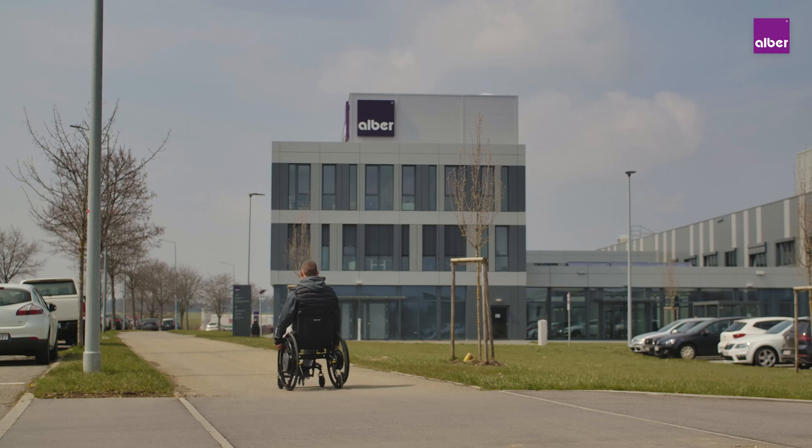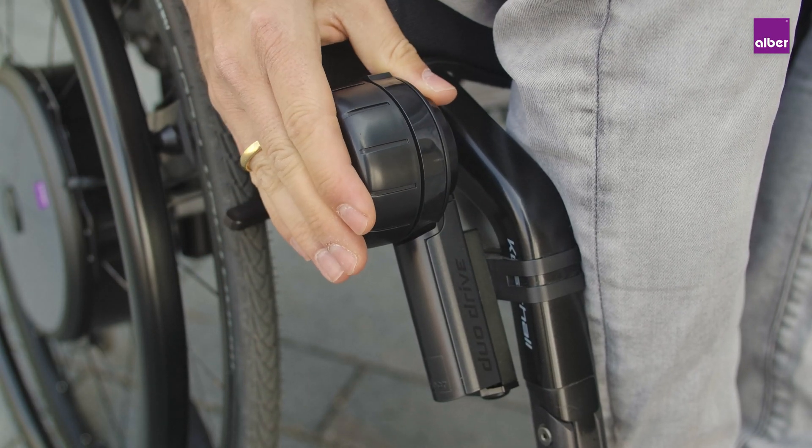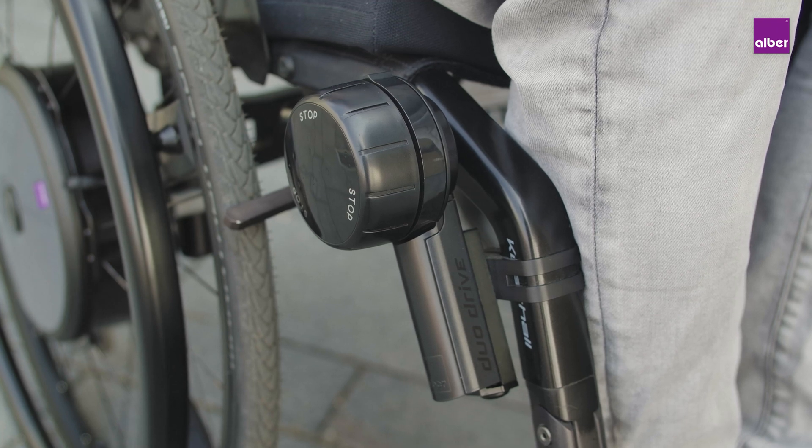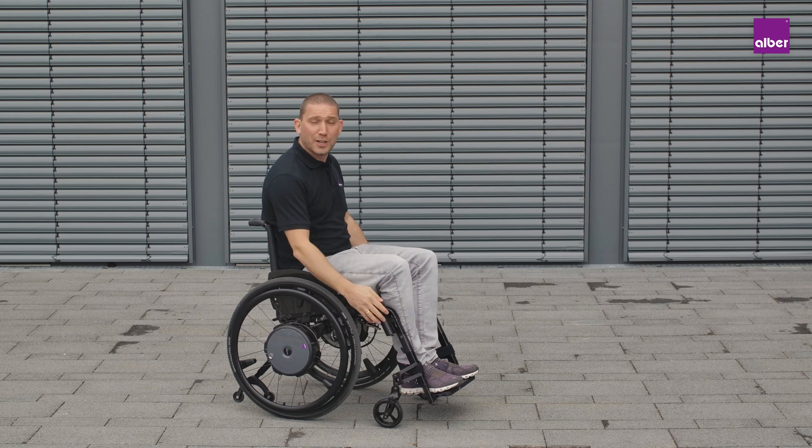One last tip: when not driving in cruise mode, a double press on the speed knob will switch between assist level 1 and 2. As we have seen, the Emotion Duo Drive always brings you home in a relaxed and safe way. Just give it a try.